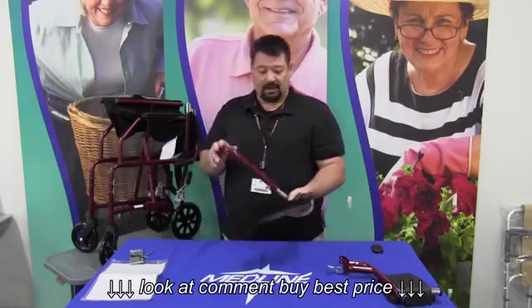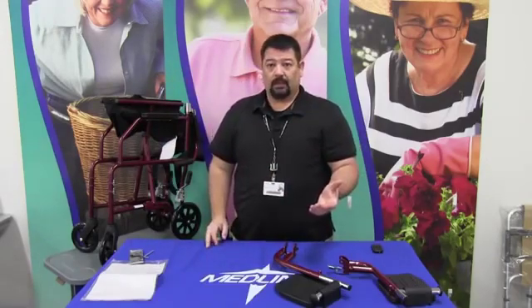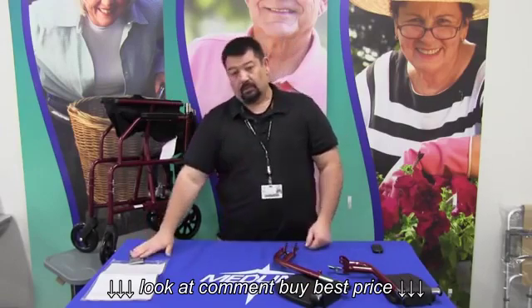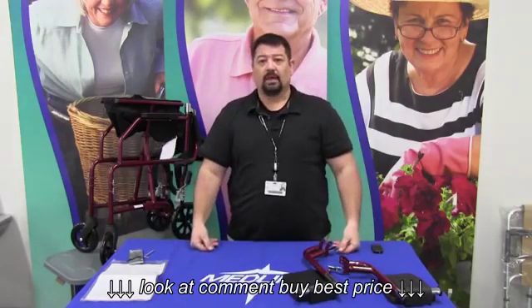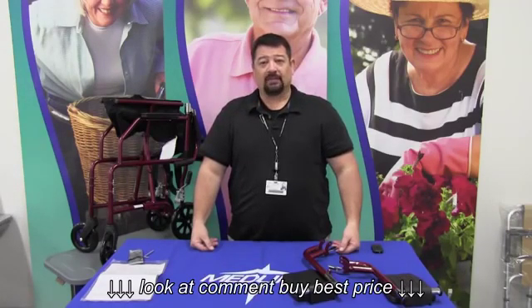Once we have that set up, the chair is ready to go and they can take it wherever they need to go. That's the chair, tool pouch, owner's manual, and legs. Once everything is assembled, everything should be good to go. If you have any questions, please feel free to call the technical support desk and we'll take care of you right away. Thanks and have a great day.